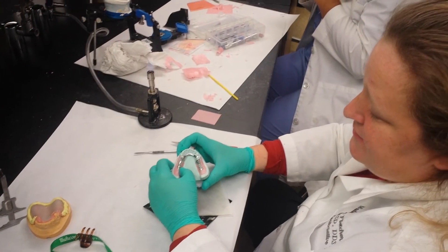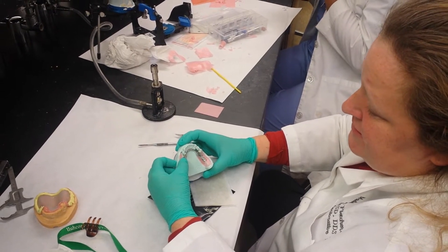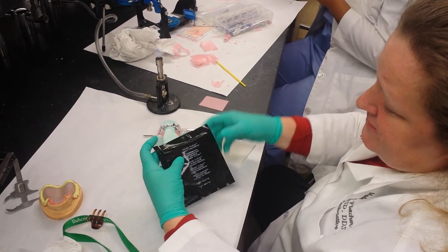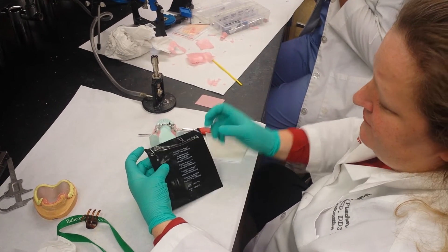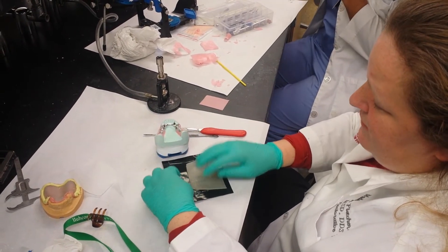Block out wax around the framework. We want to make a custom tray attached to the framework so that we can make an altered cast impression in the patient's mouth. I like to use this Triad custom tray material. It has nice fibers in it and it cures in just a few minutes.